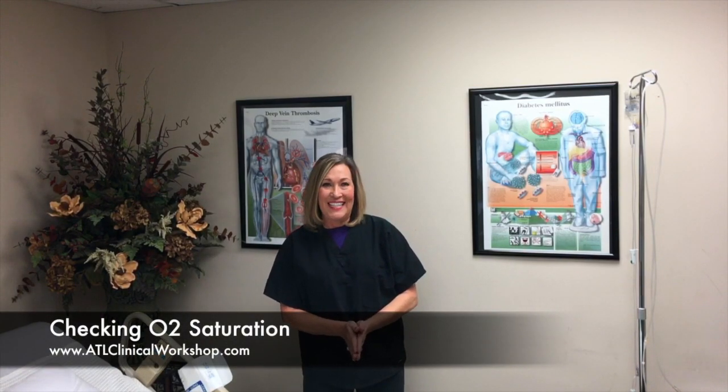Hey guys, it's Sherri Taylor with ATL Clinical Workshop. Today I had a question posed to me about how do I check O2 sats on a patient that has fingernail polish on.